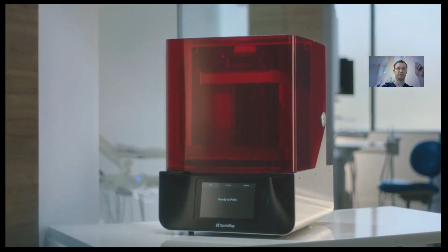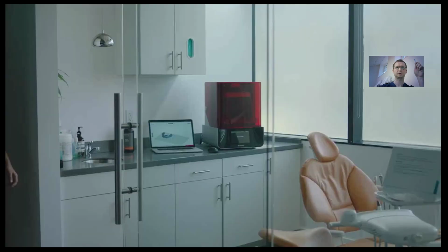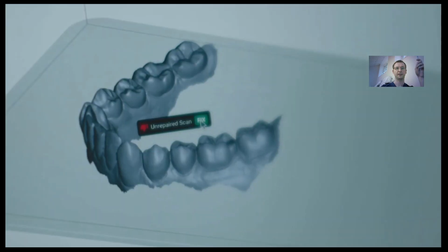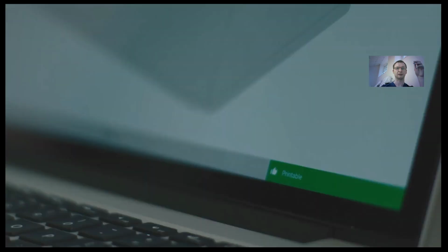Now they can make many different things: temporary crowns, mouth guides, aligners, surgical templates, and many more. Traumatologists also started to use 3D printing, for surgical models, templates, spacers. We decided not to stand aside and to investigate this issue.